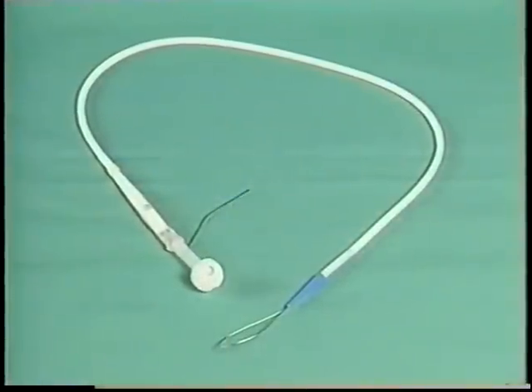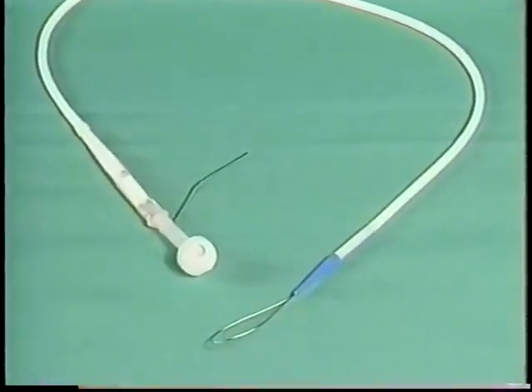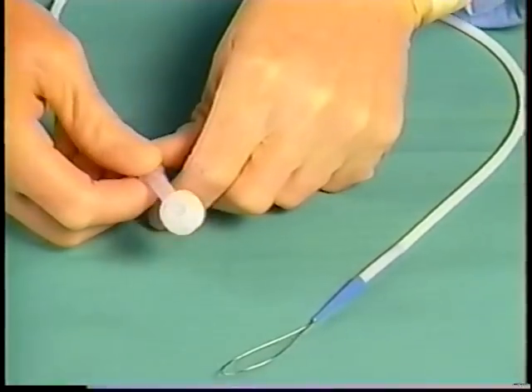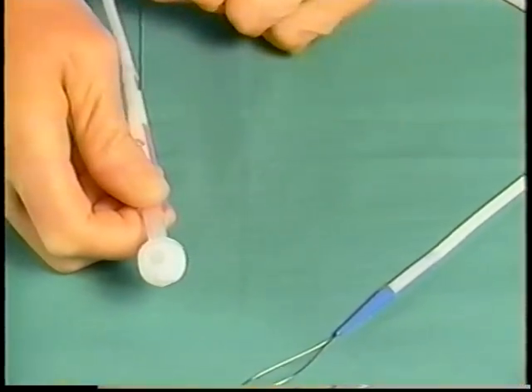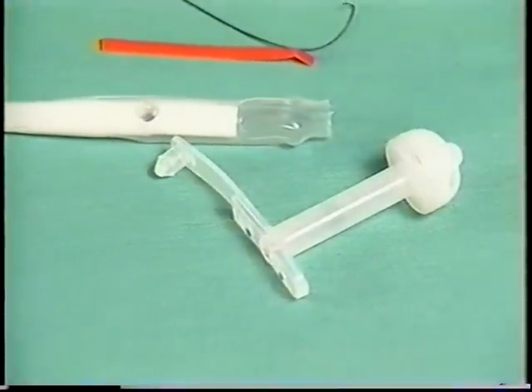There are also systems available which allow placement of the low-profile device at initial PEG tube insertion. This avoids the necessity of having the patient return after initial tract formation for removal of the PEG tube and placement of a low-profile device.